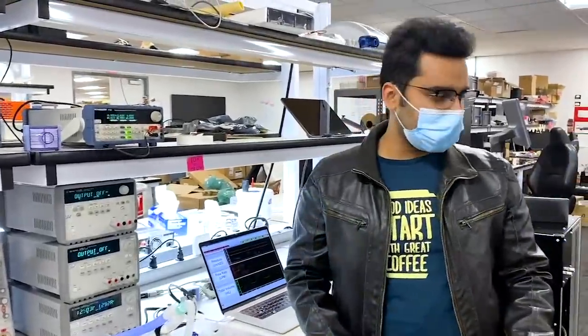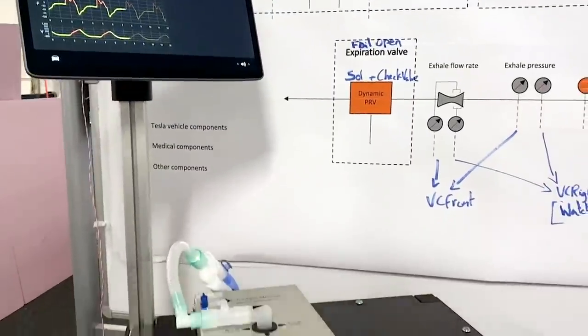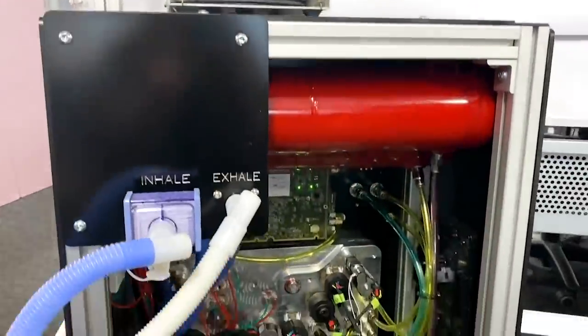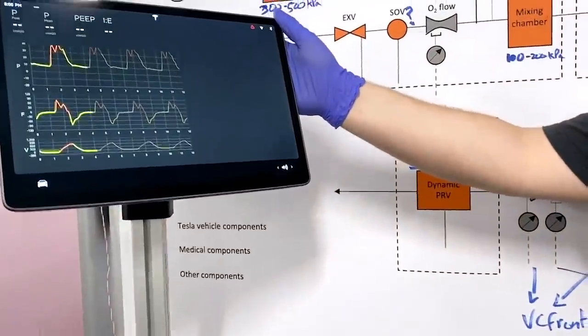And now I'm going to put you over to Ben who's going to show you the packaged version of the same. This system is powered by the Model 3 infotainment system. Up here at the top, we have a Model 3 center display touchscreen.